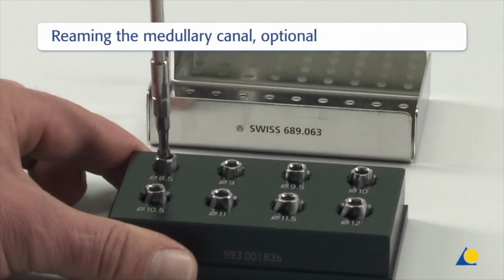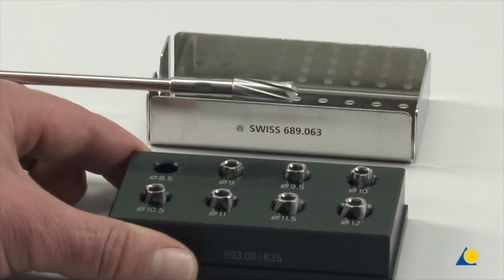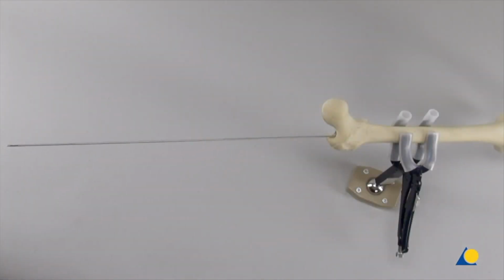To begin reaming, the 8.5 mm diameter reamer head is attached to the flexible shaft by inserting the tip of the shaft into the cannulation of the reamer head in the tray. Observe that the 8.5 mm reamer head is the only head that has a cutting tip. The assembly is guided over the reamer rod into the medullary canal.